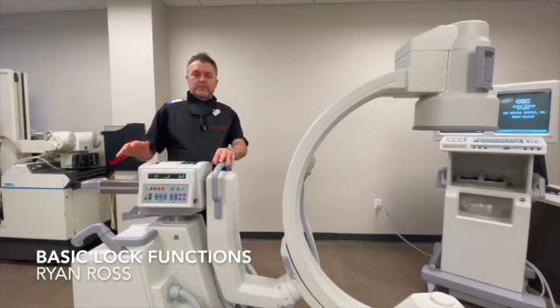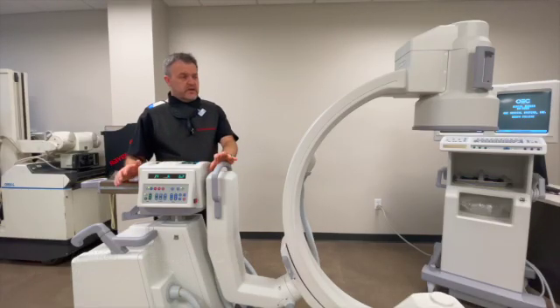Here's a brief overview of the four main locks that are on a C-arm. If you're using a GE C-arm that has the SmartView lock, then you would have five available.